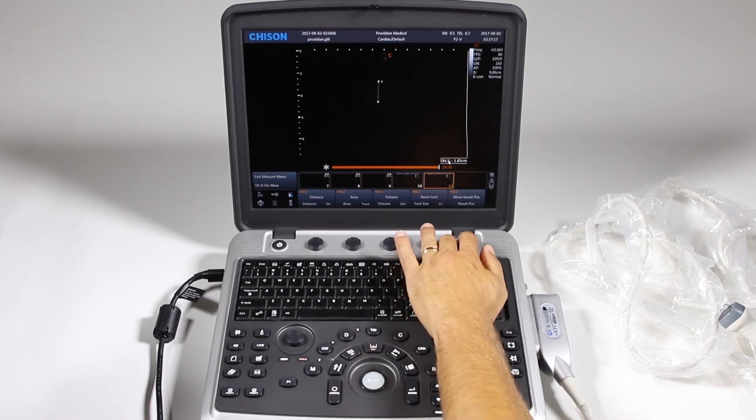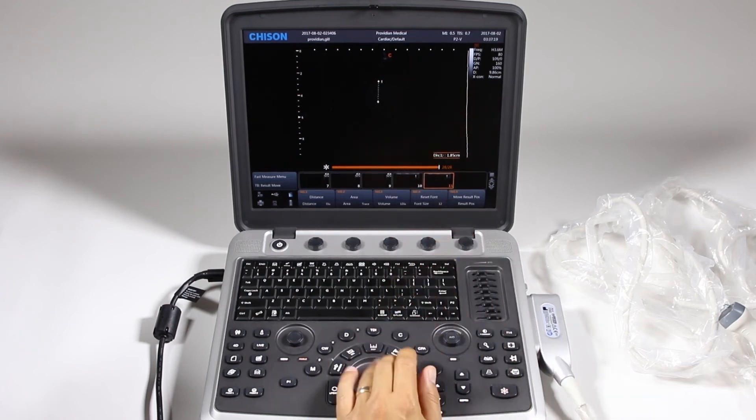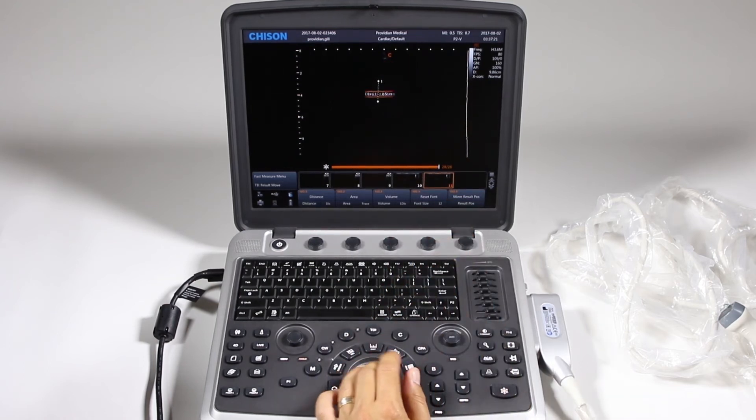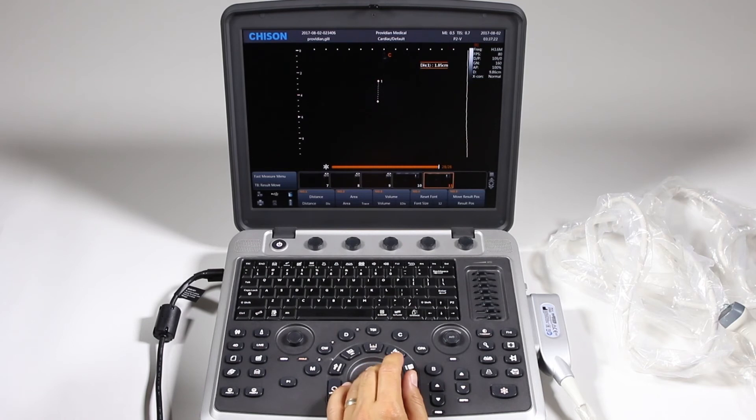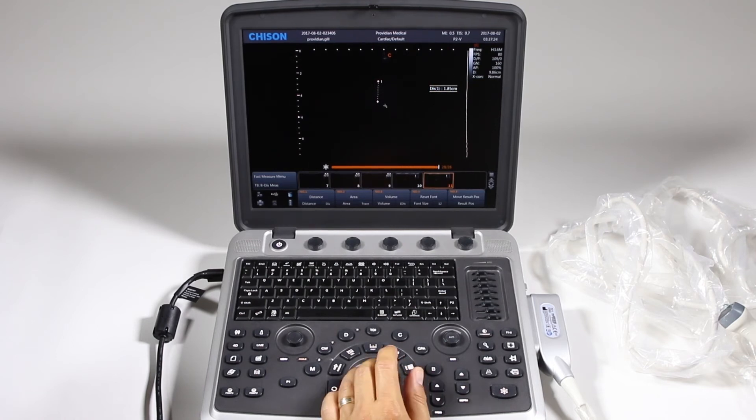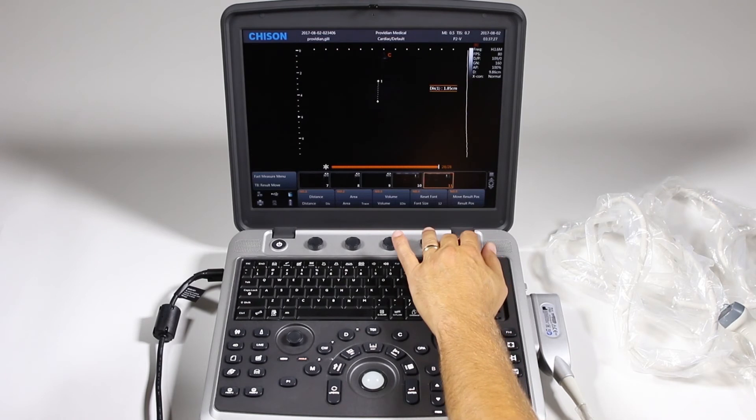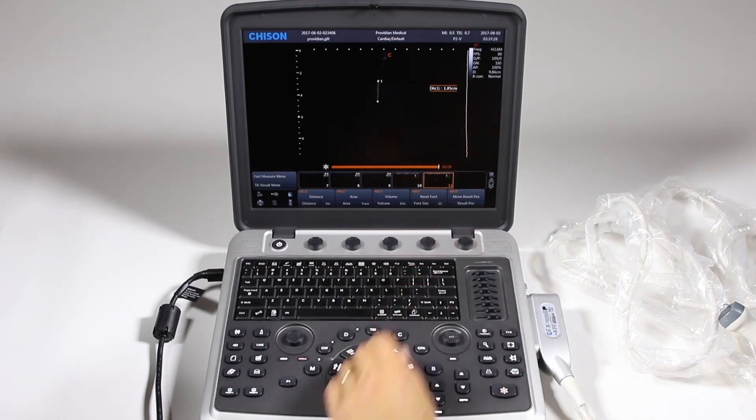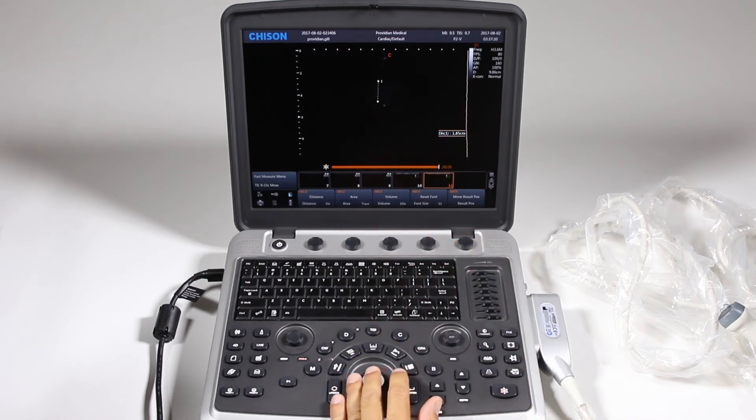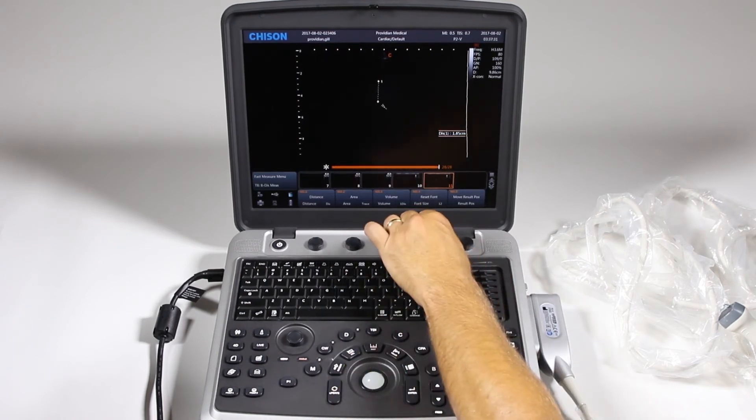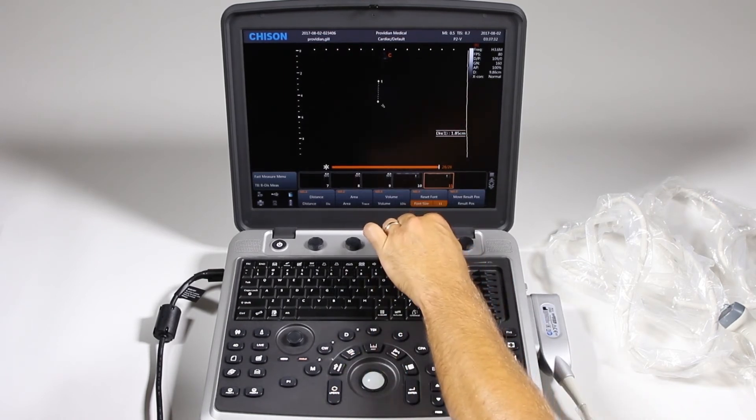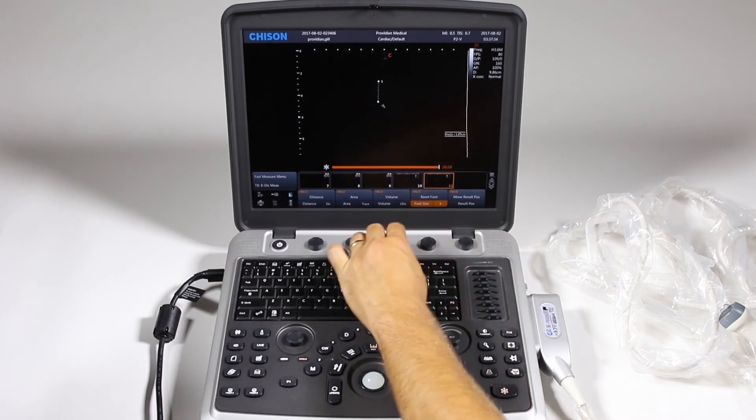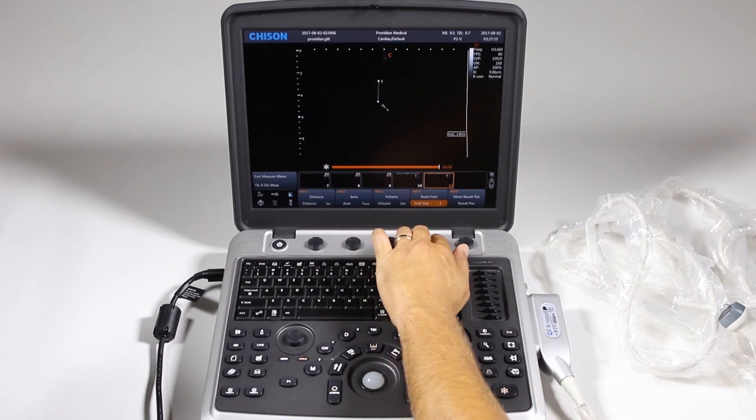But one thing real quick, you can click here and say move result position. If you don't like where it's located, you can move it around and hit set. So that's just sitting there by pushing here and you can move it and click set. Same thing with font size. You can change the font size of your measurement.